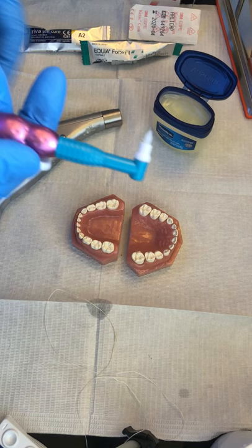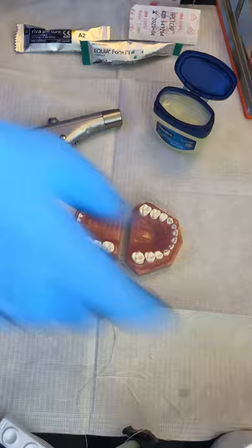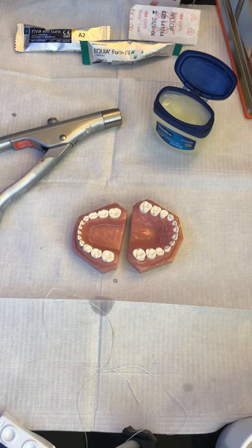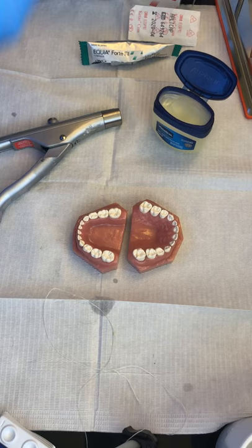The teeth are prepared. Of course in the mouth they should be a little bit moist, so I'm going to spread just a little moisture layer on there, since there's no saliva in this patient as you can see. We're going to use the Riva just for fun — we love all these products. And the Riva — you know what it says on the package when you open the box? It says don't click.